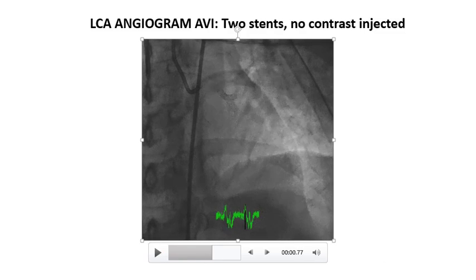Again, it's only intended to demonstrate the possibilities, the differences in imaging. You will not see coronary arteries routinely in echoes. You might see a big vessel from time to time, particularly at the origin of the left main, but that's pretty much about it. You will not likely visualize coronary arteries.